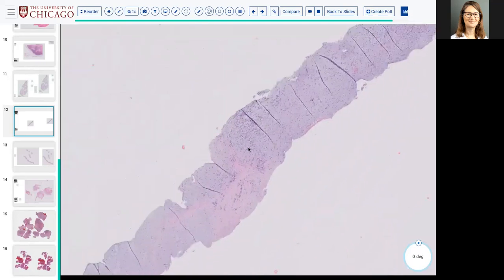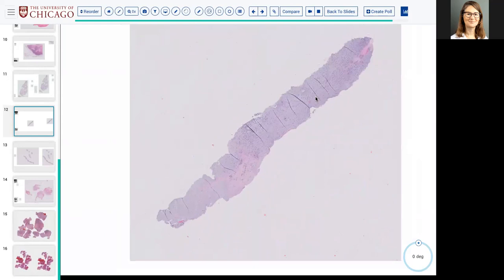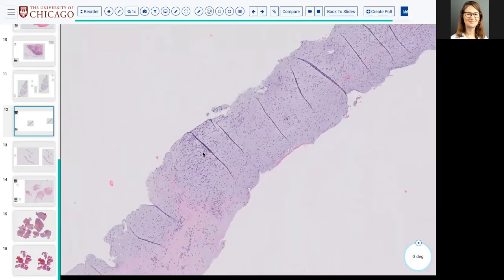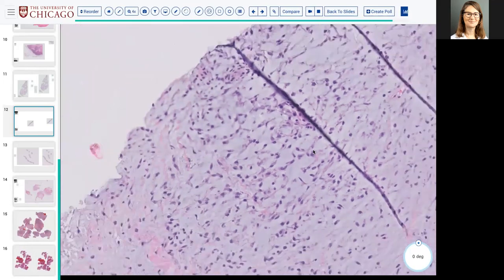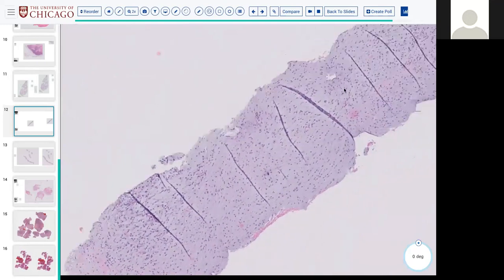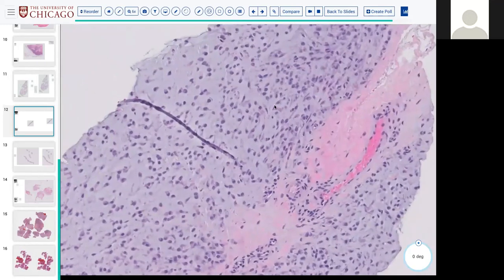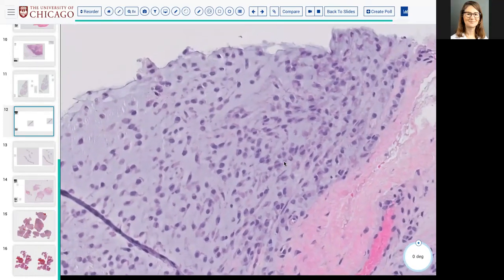So we have to shift our viewpoint a little bit. And it's quite large. If you think about superficial acrofibromyxomas, they tend to be kind of small-ish. This is a nice core of what appears to be a perhaps larger lesion, but that's definitely a consideration in the right context. Could we think of extraskeletal mesenchymal or myxoid chondrosarcoma? All right, so tell us what you know about that.